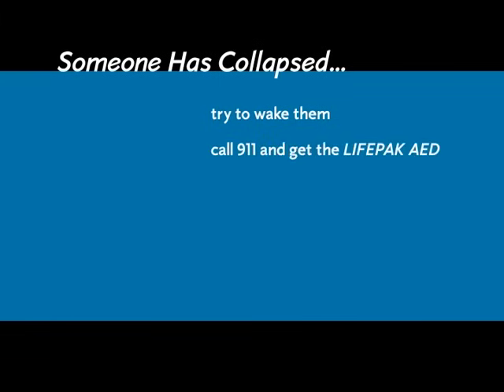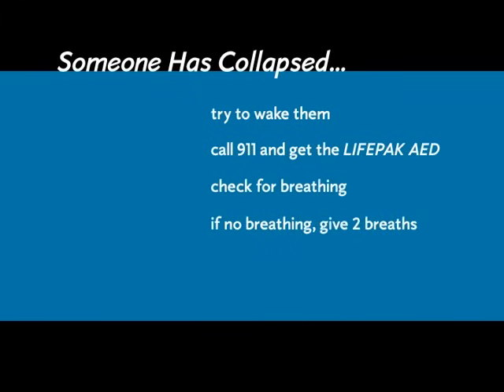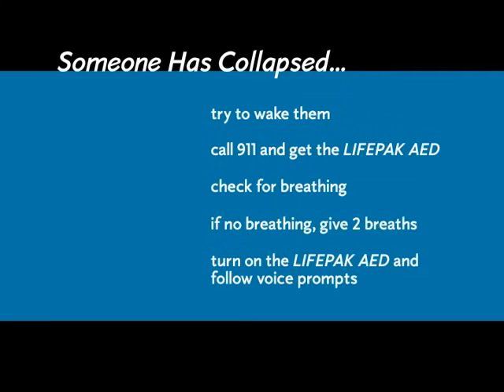First, I'll list the steps, and then we'll go back over them in detail. If you see someone collapse, or you find someone already collapsed, first, try to wake them. If they don't respond, call 911 and get the LifePak AED. Open the airway and check for normal breathing. If necessary, give 2 breaths. Turn on the AED and do what it tells you. It will guide you through the process. Now let's go through that in detail.